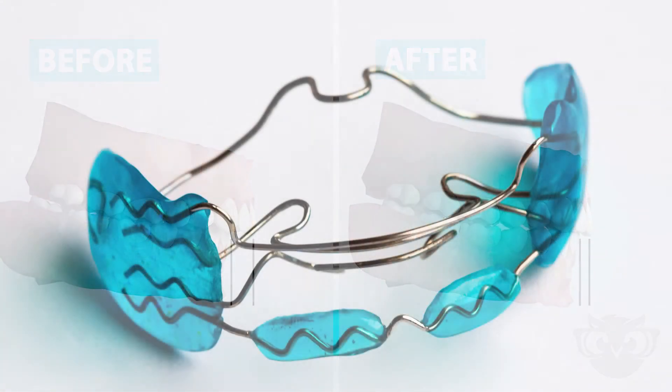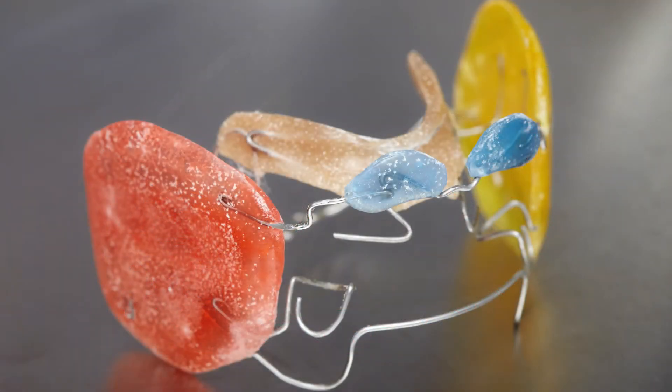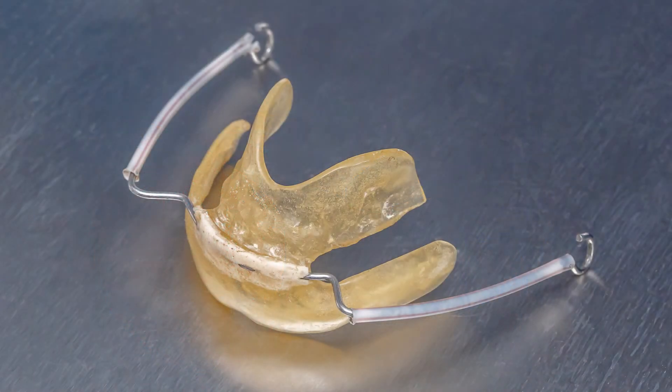There are many different styles of removable functional appliances. Your orthodontist will help design one to fit your needs.